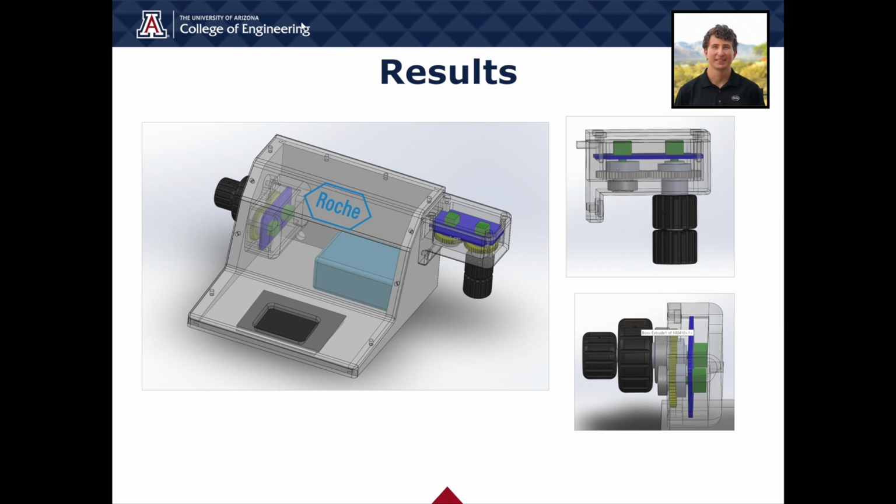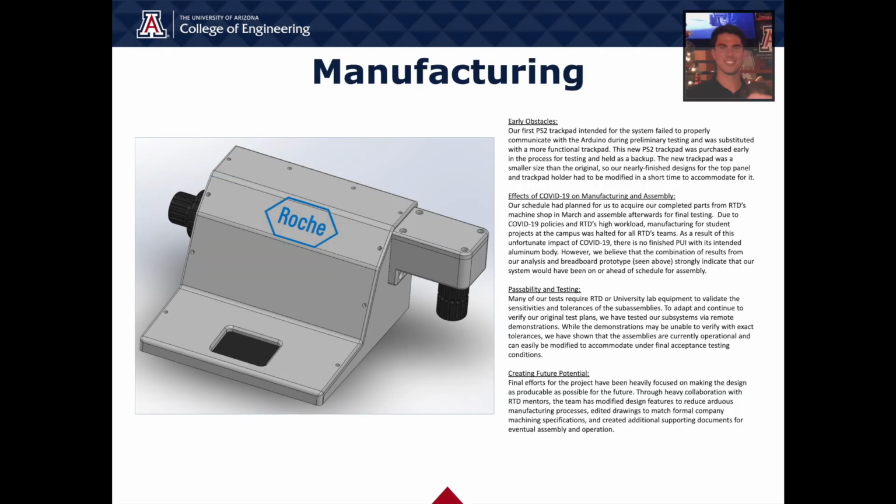Next, Matt will be talking about the manufacturing process of our project. In our first semester, we got off to a quick start developing a prototype design and assessing the functionality of our subassemblies. We acquired all of our operational parts and designed a frame to contain them.